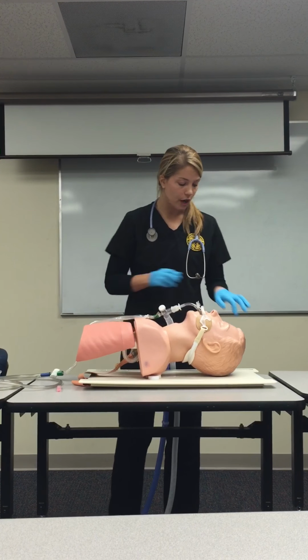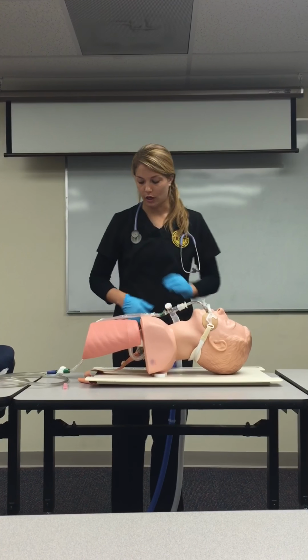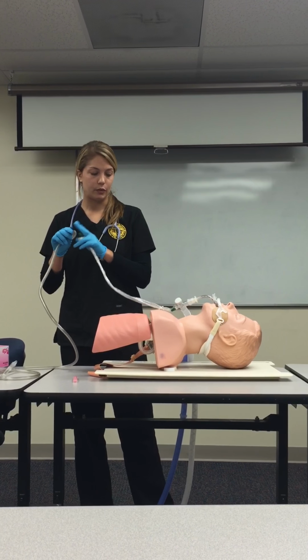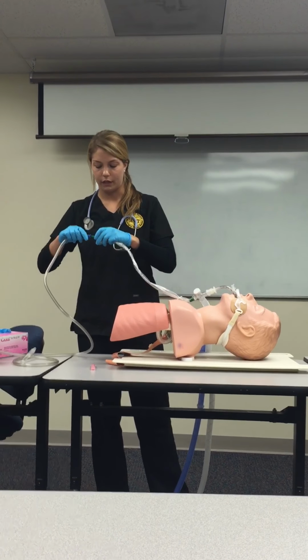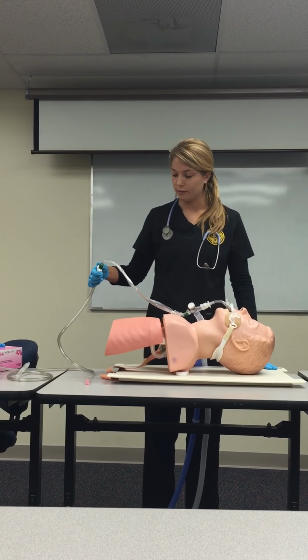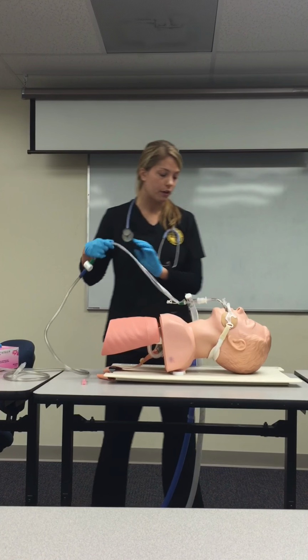I would tell him, Mr. Doe, I'm going to suction you today. Previous to suctioning him, I would go ahead and check my suction. I would make sure it's between -100 and -150. I would hyperoxygenate him for up to 30 seconds. I would check my thumb port, make sure it's unlocked, and then I'm going to go ahead.